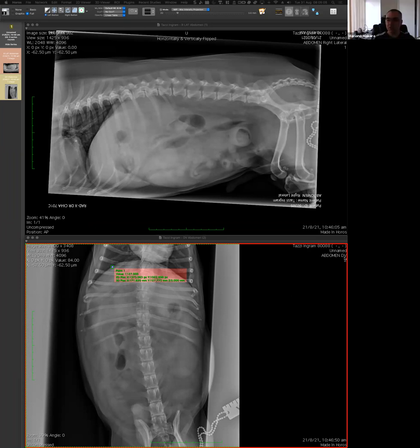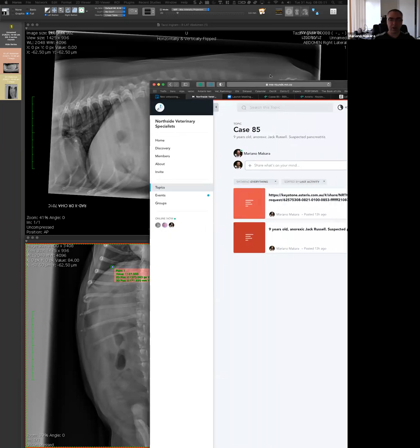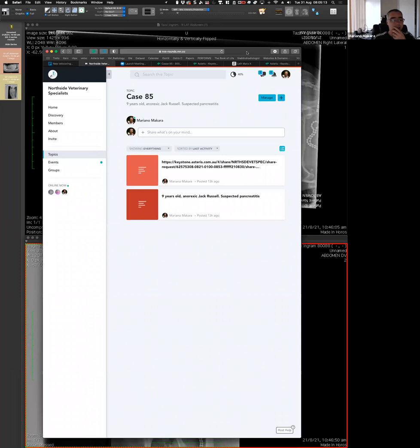Oh, no. And then what is missing is I need to give you some kind of information about the patient. So the history. So let me share that. I usually share exactly what I get, to make it a more real situation. I'm sure you would love to have more information. This is not a very unusual thing. Usually imaging is one of the first things we do. So usually we have not so much information.